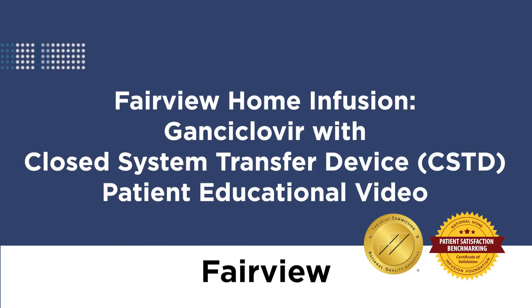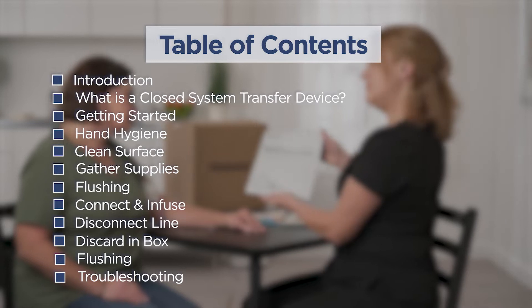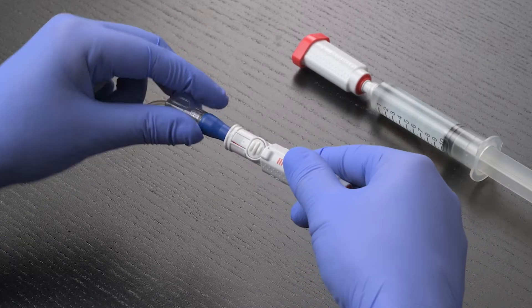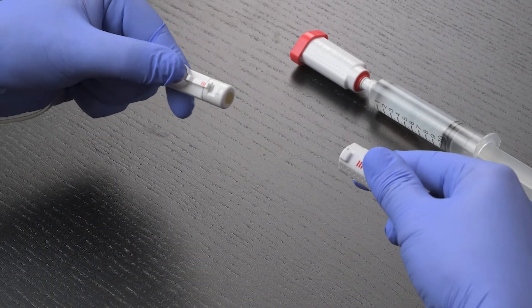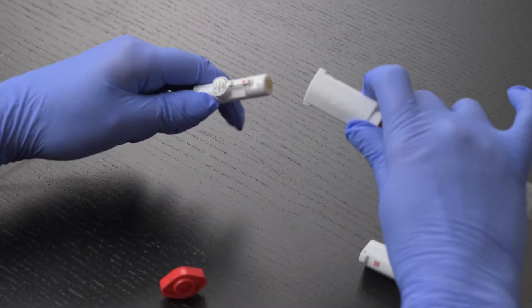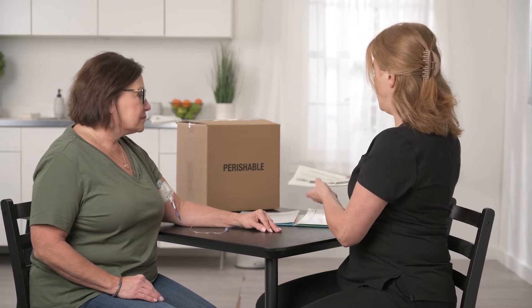Welcome to Fairview Home Infusion. In this video, we will demonstrate how to properly administer Ganciclovir at home using a closed system transfer device. The safety device you will be using to connect and disconnect your medication is called an Equishield Closed System Transfer Device. It is a special connector used with drugs that would be hazardous if they leaked out or vaporized and were breathed into the lungs. Ganciclovir is considered a hazardous drug and the special connector prevents any accidental exposure. A Fairview Home Infusion nurse will be present for the initial instruction and available by phone for questions for your future infusions.